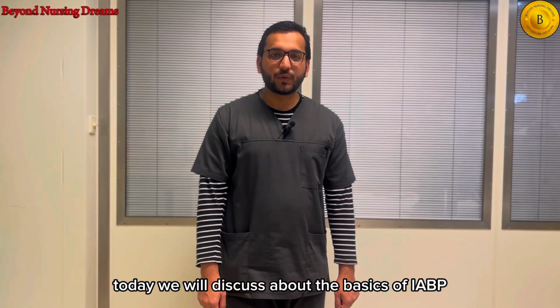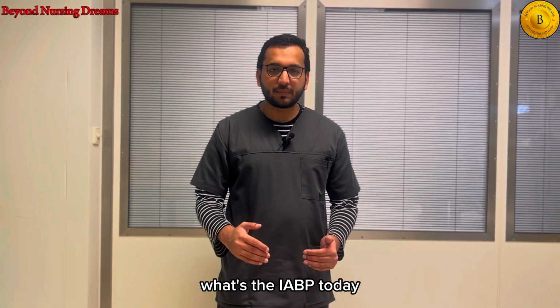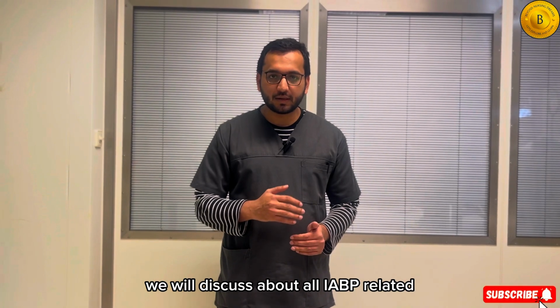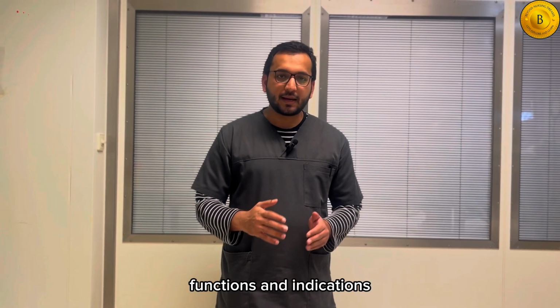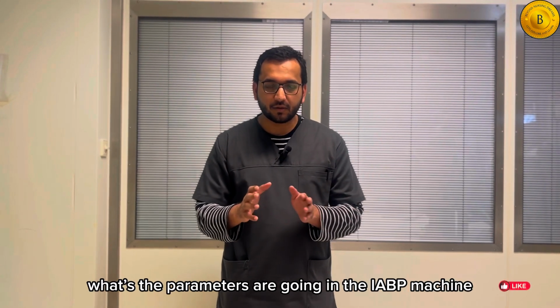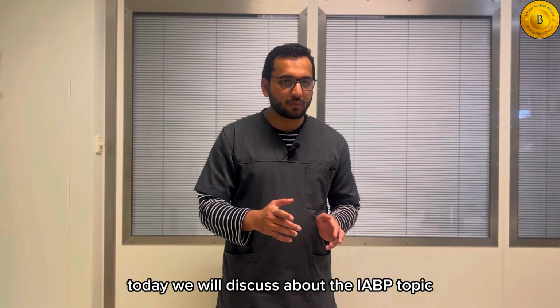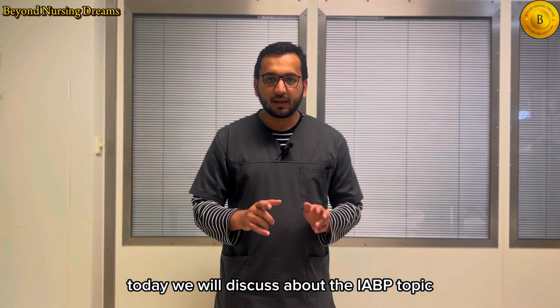In this video, today we will discuss the basics of IABP. What is the IABP? Today we will discuss all IABP-related functions, indications, contraindications, and the screen of the IABP, what parameters are going in the IABP machine, and what the components of the IABP machine are.